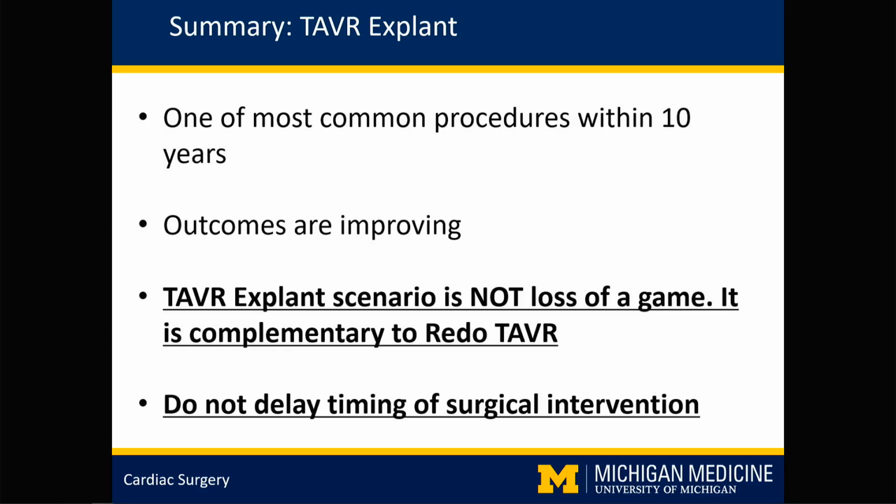To be honest, I have some of the most updated Medicare data, and I know more than 50% of TAVR centers had zero TAVR explant experience. So I think we have to show that TAVR explant is not something bad.